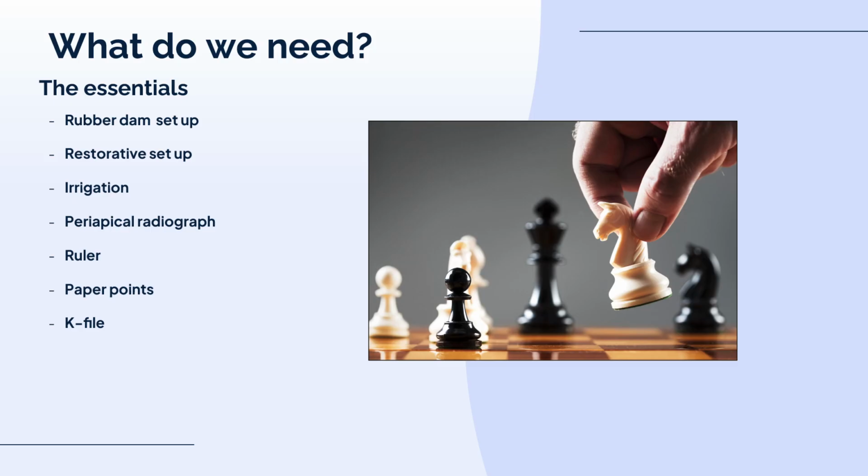Okay, so what do we need? The good thing about root canal is you need the same things over and over again. Okay, the only time it differs is when you're doing specific things for that appointment. Okay, so when we get to it, I'll talk about it, but you don't need the rubber plugs for stage 3 in the first stage. Okay, so these are the essentials. These are what you need every single appointment.